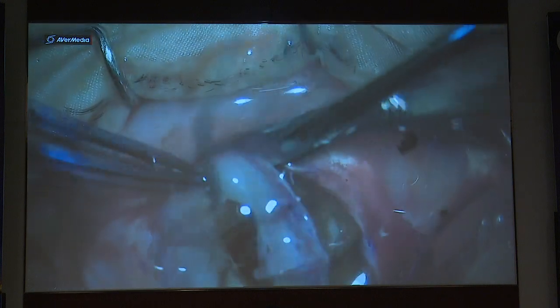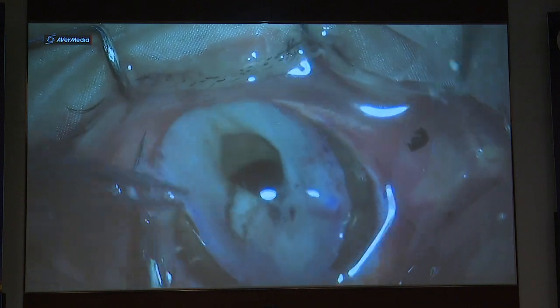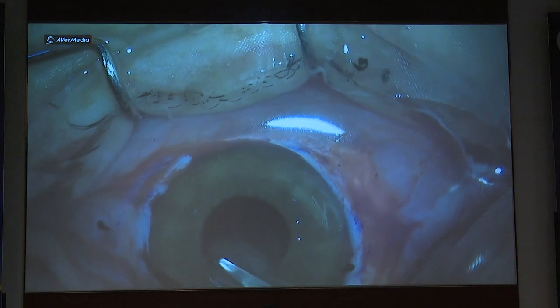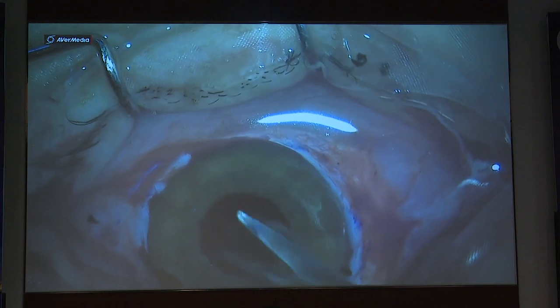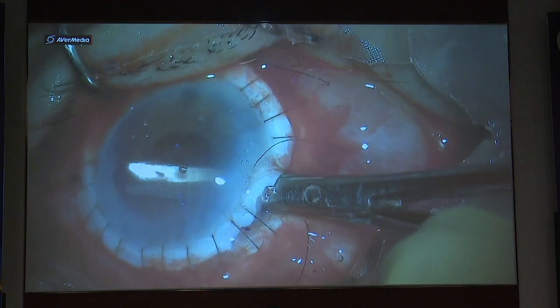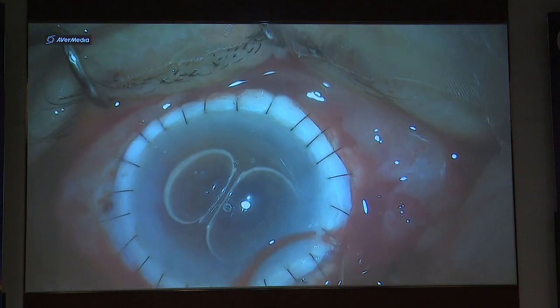Thankfully, the anterior chamber did not have much exudates and the iris also looked healthy. Vitrectomy machine was not available on that day. So I did a manual vitrectomy and did the suturing. At the end, I checked for any synechiae or any remaining vitreous tags, completed the vitrectomy, and closed the case.